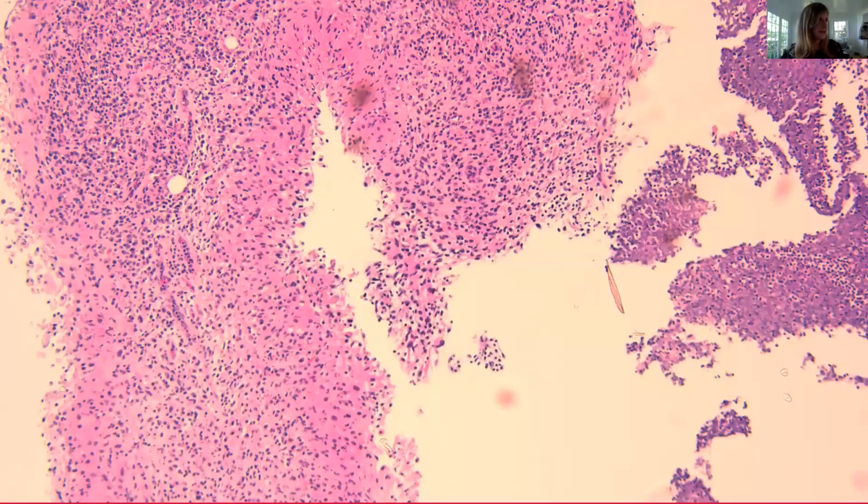So on this tissue sample, we have amorphous tissue fragments. We don't have any epithelium to show us what it is. And there are two distinct looking areas. The first area is right here on the right-hand side of the screen. You can see it's a bit more purple and more smeary or smudgy. You can see these tiny little cells here. So this is an area of necrosis, and the smudging is DNA from necrotic cells. There are more neutrophils in this area, which means this was kind of like pus in the lesion.